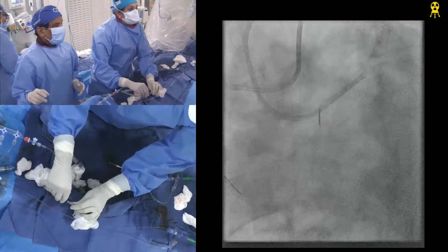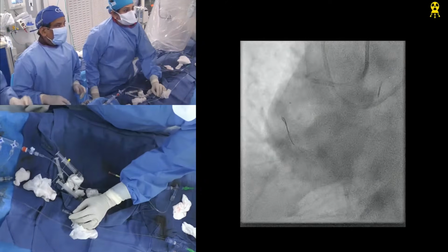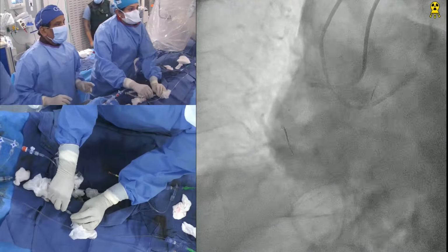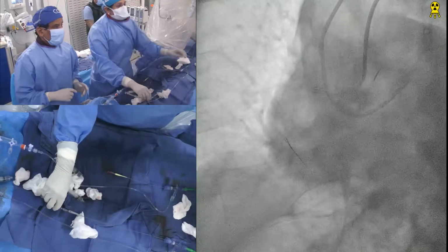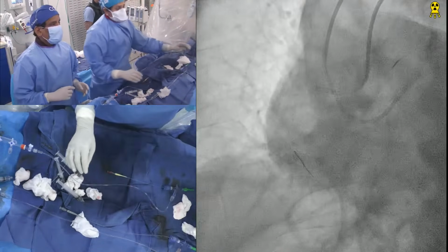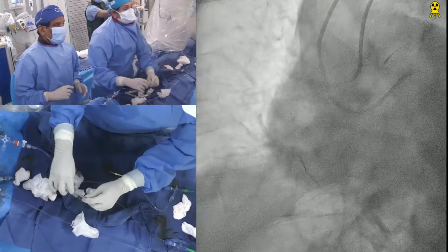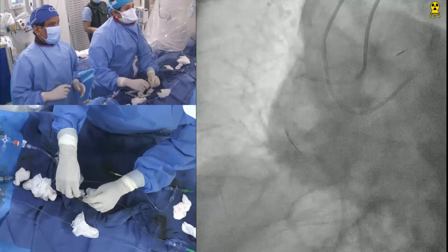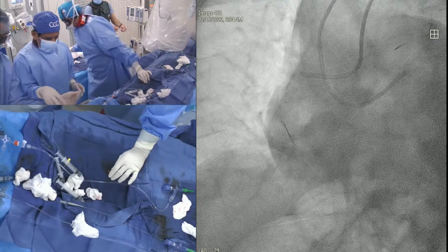We just want to see if the Fielder can go. And I'm just telling Anu to try to see if it can go or not, rotate. No, it's not doing anything. But I'm saying you have to get your device further. Guide, nothing is happening. I do not want to touch it because right now it could be negative for us. See, it's coming out. Fine. Okay. This is the Fielder.